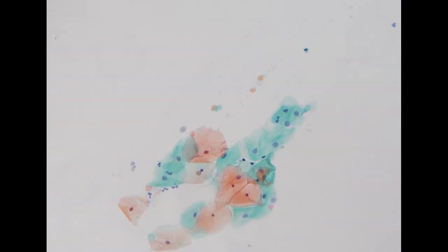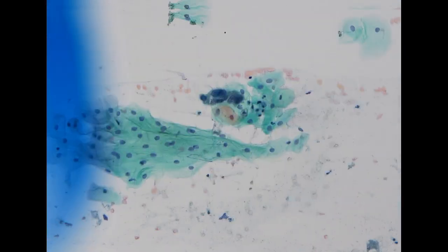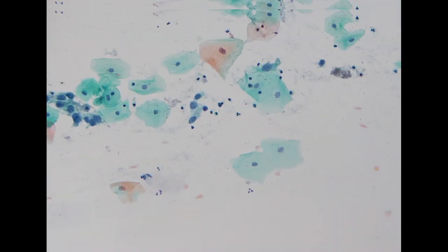The patient does not have a prior pap smear. When we diagnose high-grade lesions, we always look for a 5-year review of prior specimens. The patient only had a positive CIN2 smear at the other clinic, and then HPV here, and this is her first smear. Along the smearing direction, you will find these high-grade cells, and you can see the differences from the normal intermediate cells. So this is positive for high-grade lesion.